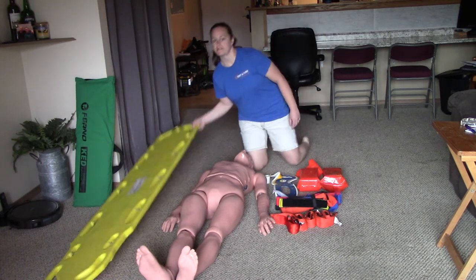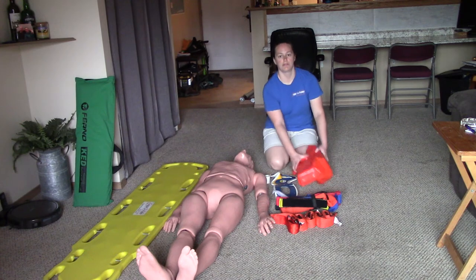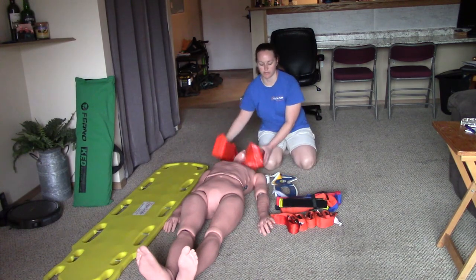First we have the backboard — this is just your standard backboard. We also have the head blocks that we'll be using to secure either side of the head once we get our patient attached to the board.